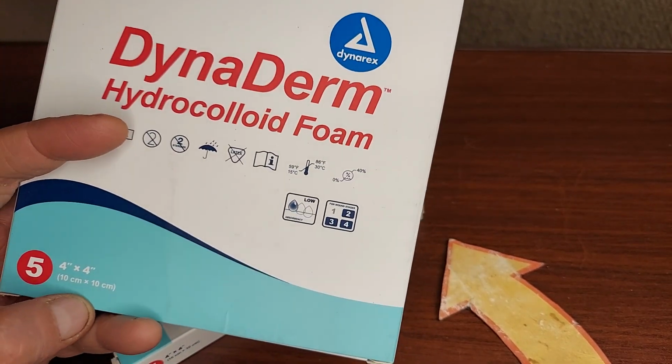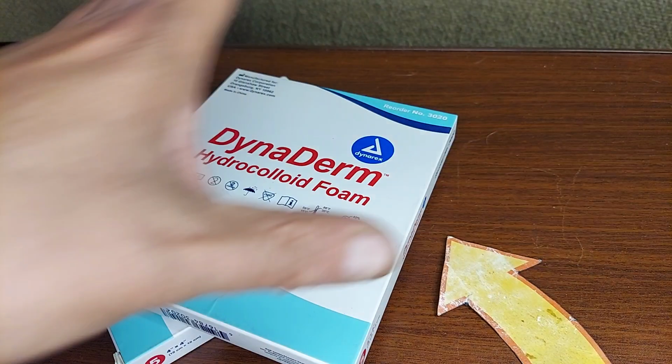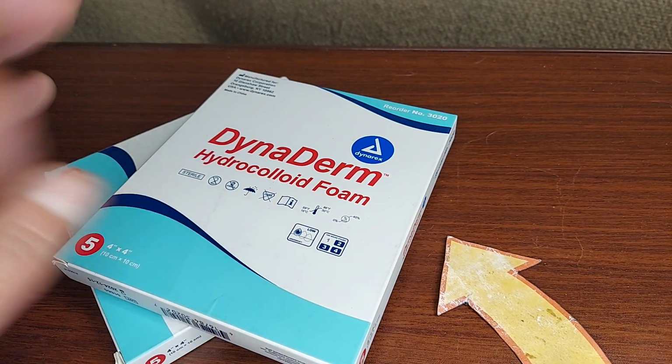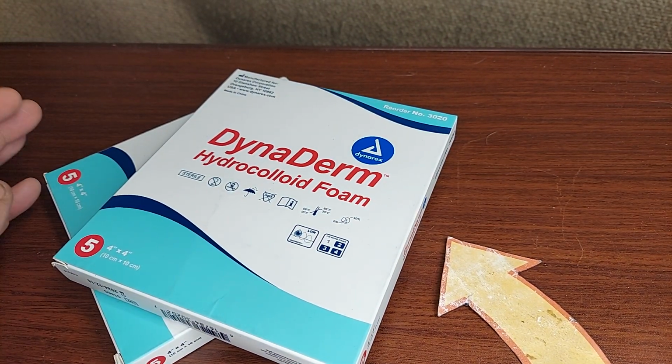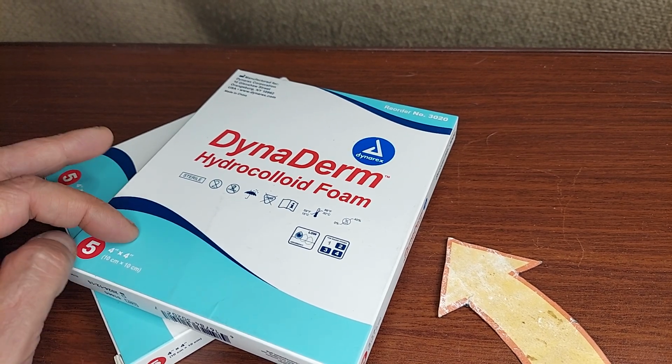So you can cut them down. These are 4x4, which is a great size for covering all the skin around the area, keeping the wound itself from any kind of contact. But if you have something really small, you can cut these down.